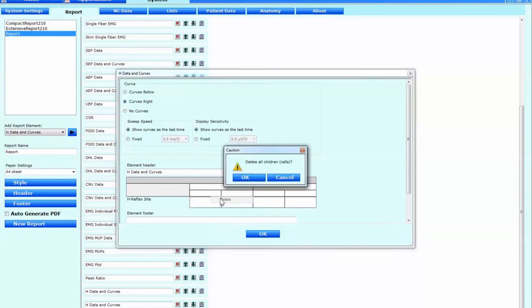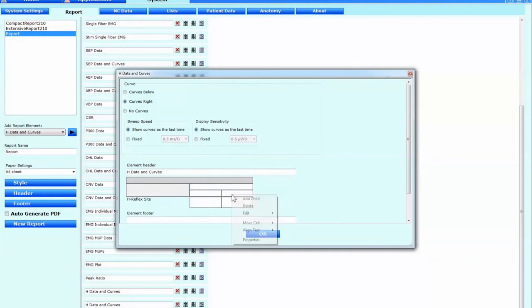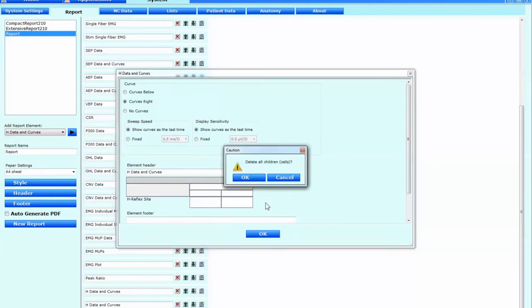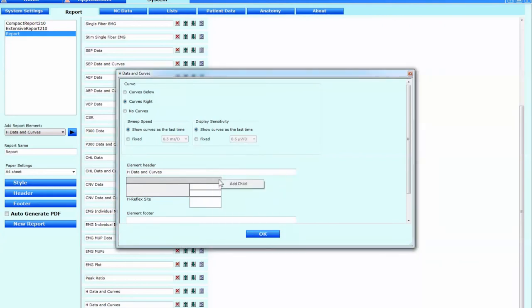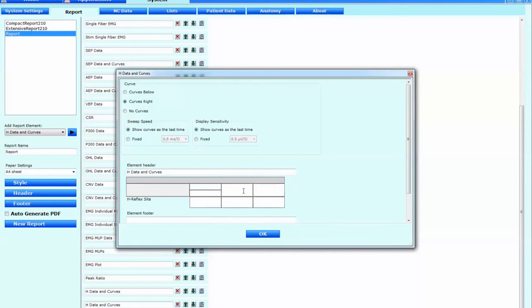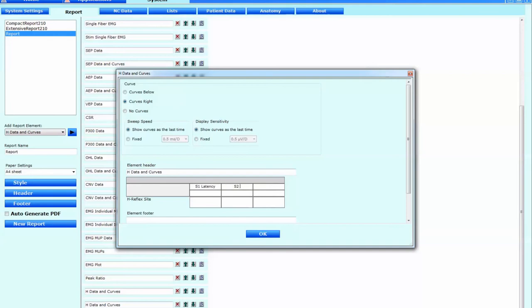The next aspect of this is we now want to put in the relevant headers and units. So what I'm going to do here is I'm just going to tidy this up a little bit. And we're going to have basically three children over here. So add child, add child, add child. And then we split those into two. And then we can type in over here our S1 latency. And in the box next to that the S2 latency. And then the cutaneous silent period which will be the difference between the two. We'll then put in the units. So milliseconds for all of those.